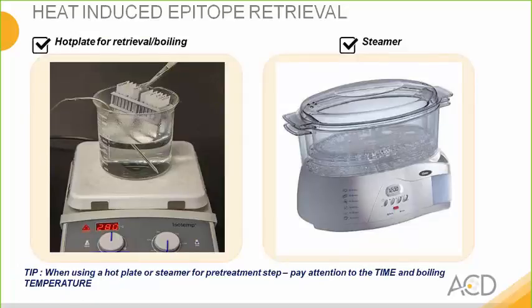Here we have an image of either the hot plate for doing your target retrieval or the steamer, which we both have protocols for. When using the hot plate or the steamer, it's most important to pay attention to time as well as the boiling temperature, which you should keep between 98 to 102 degrees Celsius. Again, the time will differ depending on what tissue you're working with, so please do refer to your user manual.